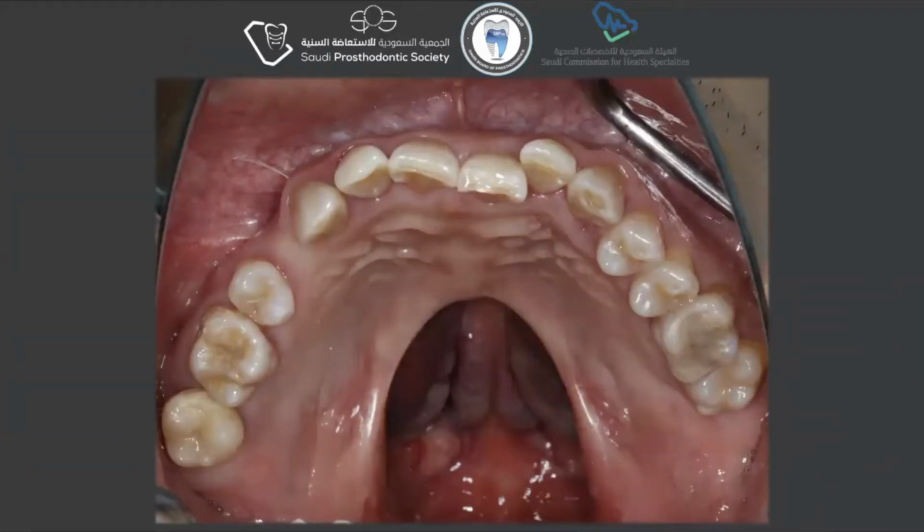According to the GPT 9th edition, an opening in the hard or soft palate as a result of improper union of the maxillary process to the median nasal process during the second month of intrauterine development is called a palatal cleft. During the intraoral examination of my patient, I found the cleft starting from the first molar area and crossing the soft palate. According to Aramany classification, the patient is a class 3. He had a speech difficulty and had never used a prosthesis or undergone any surgical repair previously.